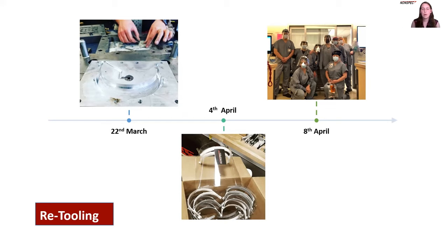And the great thing about moving to scale is that in very early April, we had this in production. Looking at the head cowl, as we call it, we were able to do that part in the lower cost material of PET. So the film actually comes up and protects the head without having to use more of the plastic that you've seen in the 3D printed models. We also started with the Prusa design, but as was mentioned, it's not scalable for mass manufacturing. So we were able to tweak that and improve on the design.